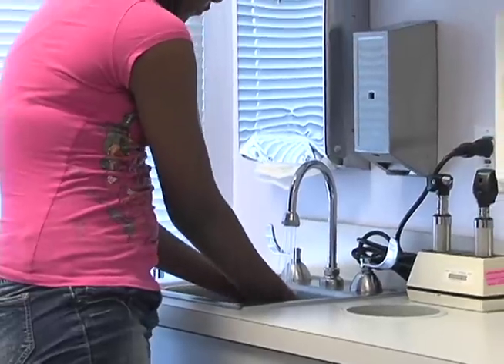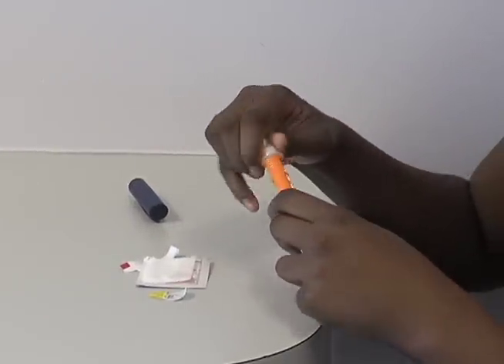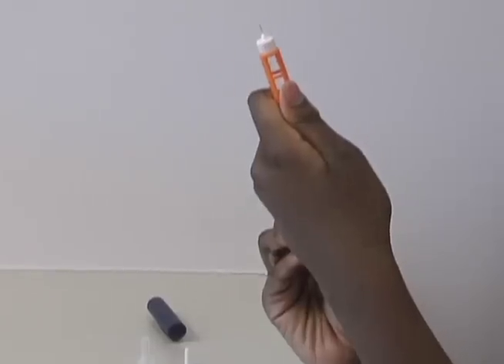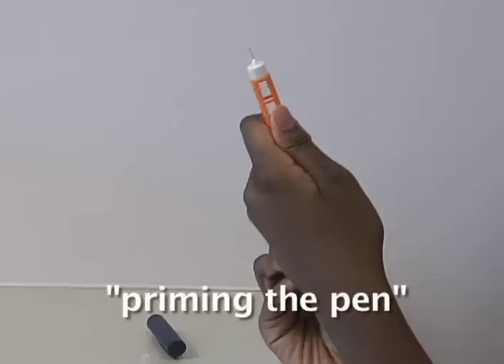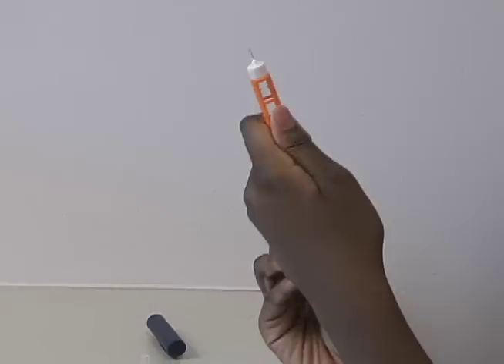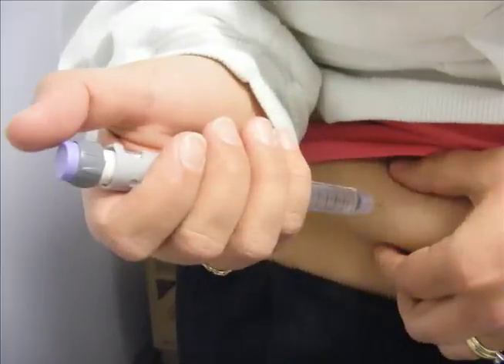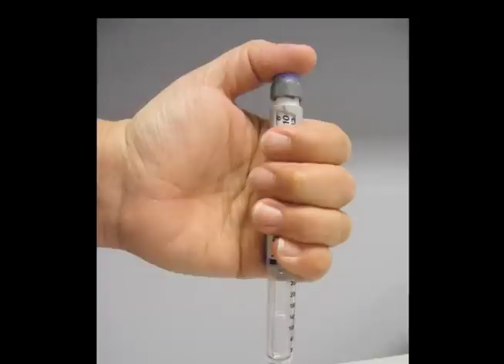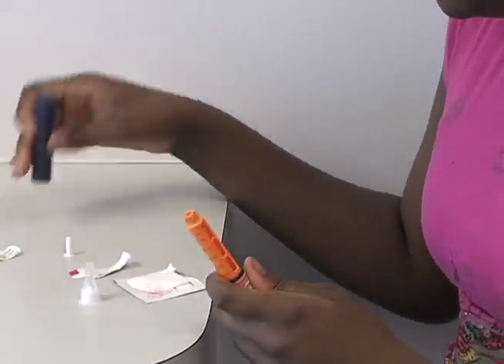All pens give multiple injections. Here's how to get started using a pen device. After washing your hands and cleaning the top of the insulin cartridge, place a disposable needle on the tip of the pen, turn the dial to the number 2, point the needle to the ceiling, and push the plunger to expel air from the cartridge. You should see insulin discharge from the pen needle — this is called an air shot or priming the pen. Priming is necessary before every injection to place insulin in the small pen needle. Now the insulin dose can be dialed. Push the pen needle into skin at a 90 degree angle, then push the plunger all the way. Slowly count to 10 before removing the needle or you may not get your full dose. Remove the disposable pen needle and place in an appropriate puncture-proof sharps container.